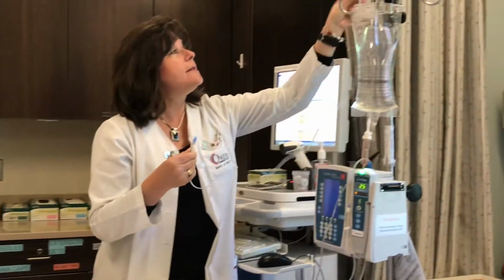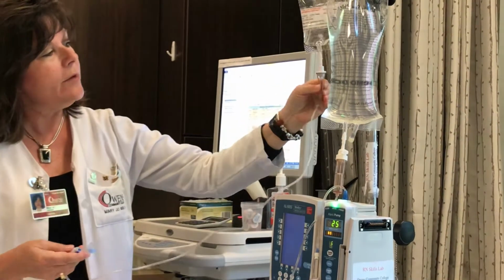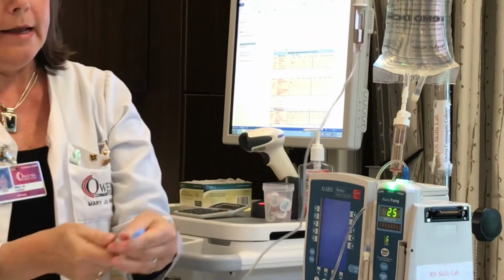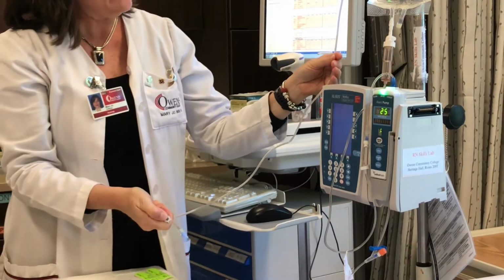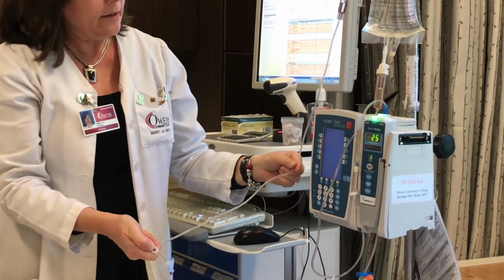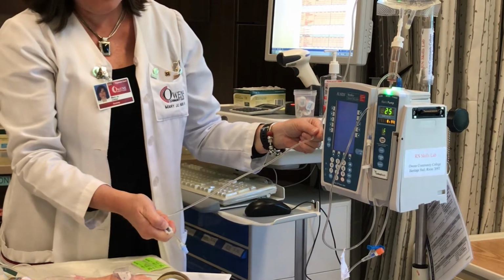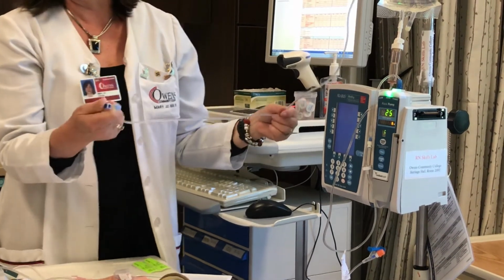I'm going to place the piggyback on my pole, and I'm going to squeeze that drip chamber till it is halfway full of fluid. And then I'm going to open the clamp and follow the fluid as it advances down the tubing, being careful not to lose any medication as it comes to the tip. Once I see a drip, I'll close the clamp.